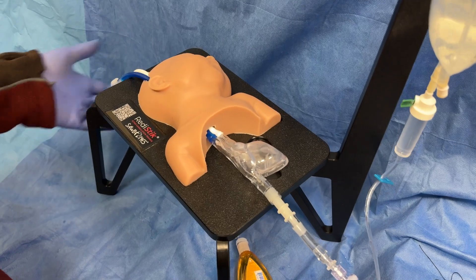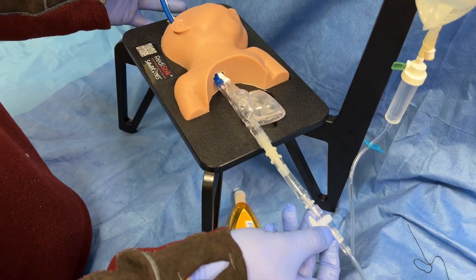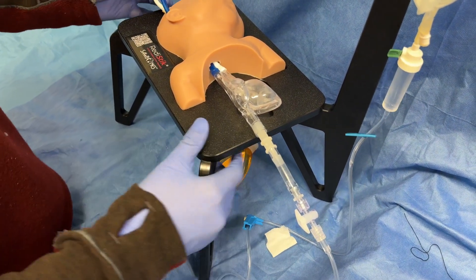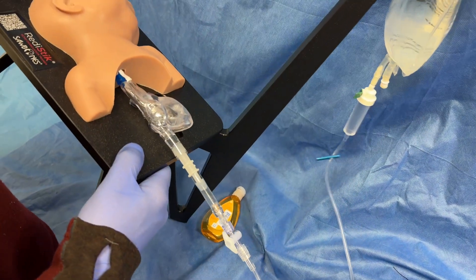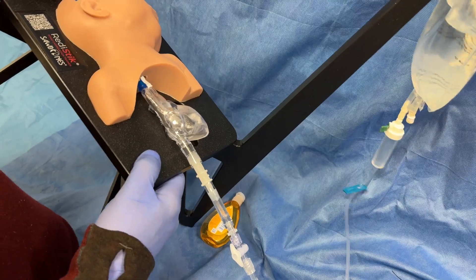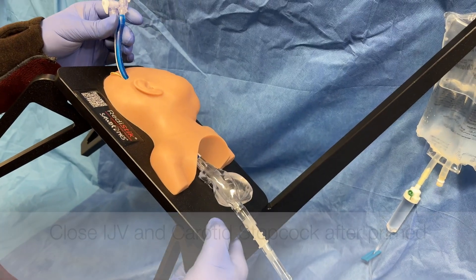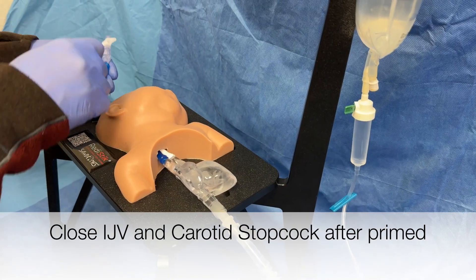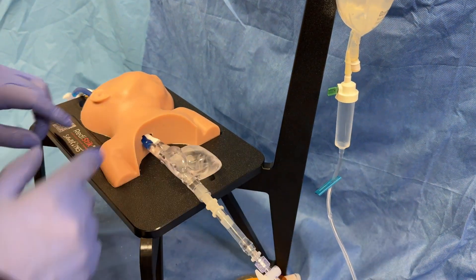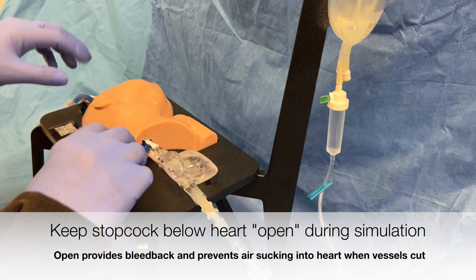Next, you want these open and you want to open this stopcock here. Make sure all your lines are open and tubing clamps are open, and it'll start to prime. We found this is the best position. If you have a friend, you can have them hold the bag up higher and it'll go faster. If you're doing this alone, once it gets up here, just clamp it with your fingers and then do the stopcock. Clamp it off, make sure all these are tight, and then look in here and make sure all that's good.